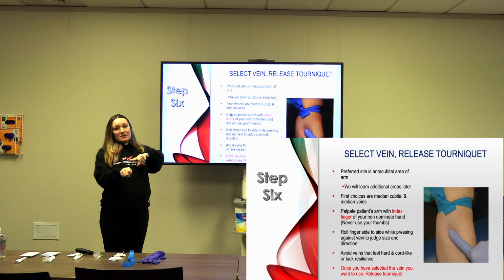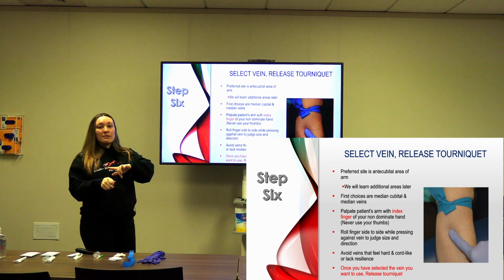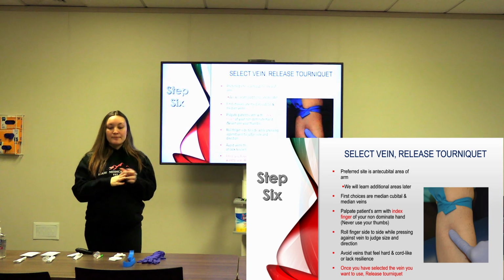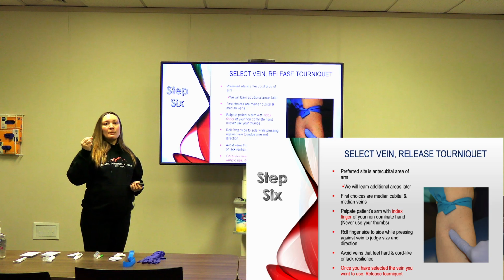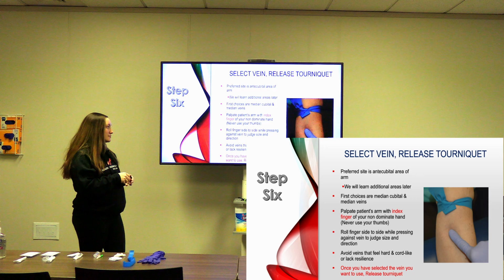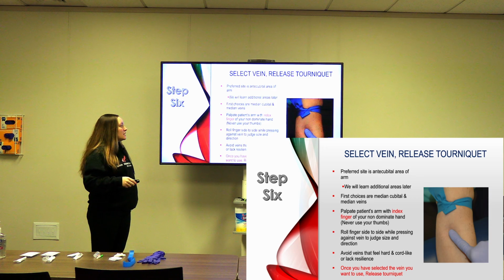If you miss, okay, you can repalpate and adjust. We'll talk about this. Not fishing like this, okay? Adjust using calculated movements, but you have to be able to feel. So you need to get practice in your non-dominant hand palpating and feeling for the veins. You can also palpate with your dominant hand before you do the poke. But generally it's just best practice to palpate with your non-dominant.